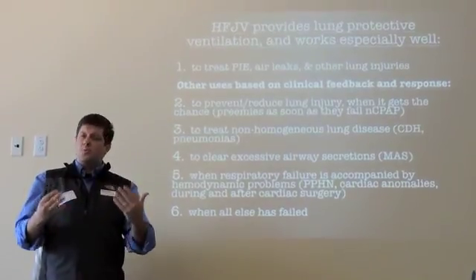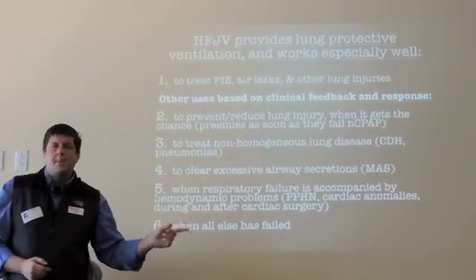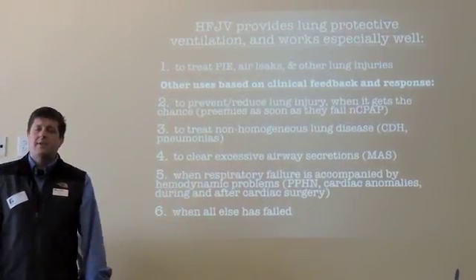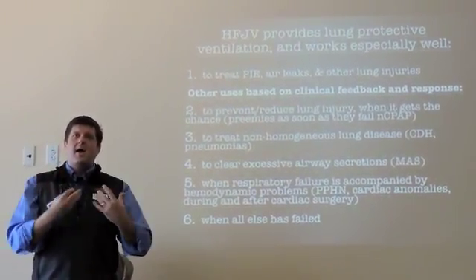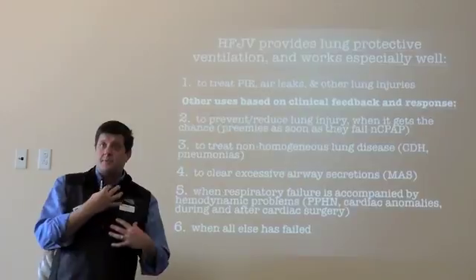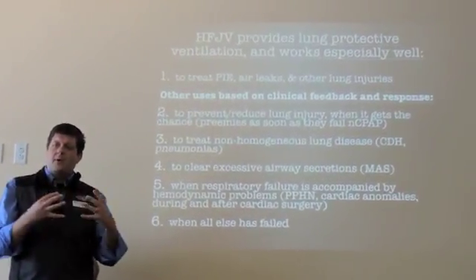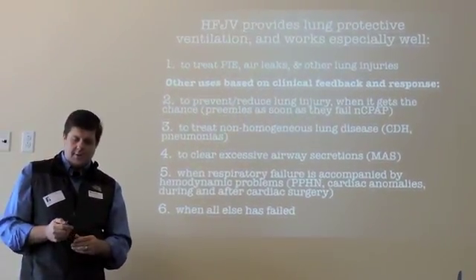If what you're doing isn't working currently, think about using the jet. Patients who have secretion issues, patients who are hemodynamically compromised. There was a paper done here by Philip Friedlich years ago, where they looked at patients who had hemodynamic compromise on an oscillator because the mean airway pressures were so high, and on echo, these patients had inflated superior and inferior vena cava, backup of blood pressure in the hepatic veins. So when patients are tearing through dopamine and volume and we're compromising things that way, if a lower mean airway pressure can help, then certainly the jet can help those patients.